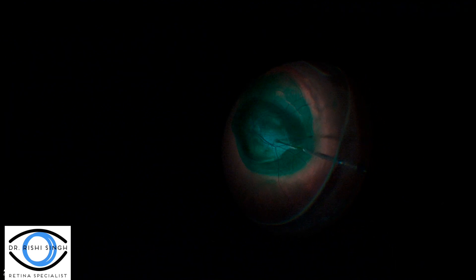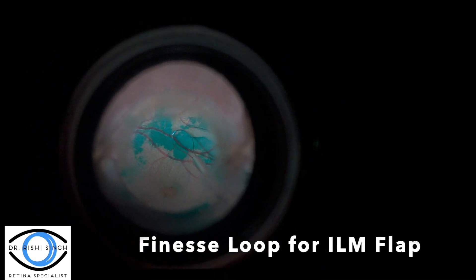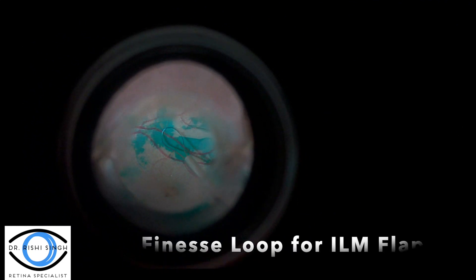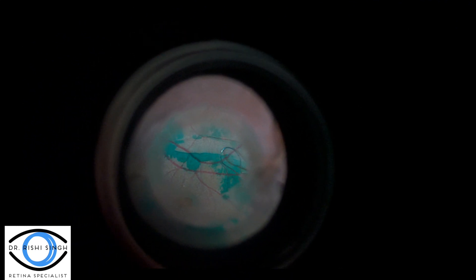In this first part of the vitrectomy, indocyanine green with D5W is placed on the macular surface, and then a finesse loop is used to elevate the tissue to create an ILM flap from which both the ILM and the ERM tissue is going to be removed.